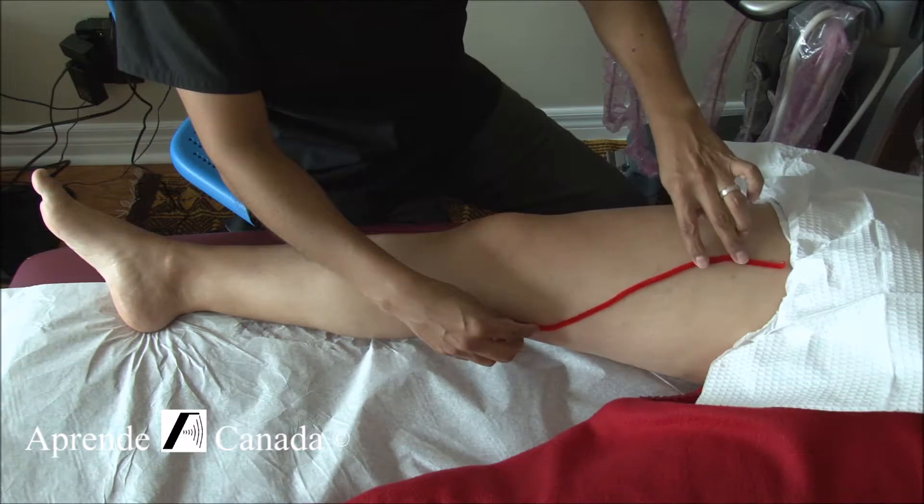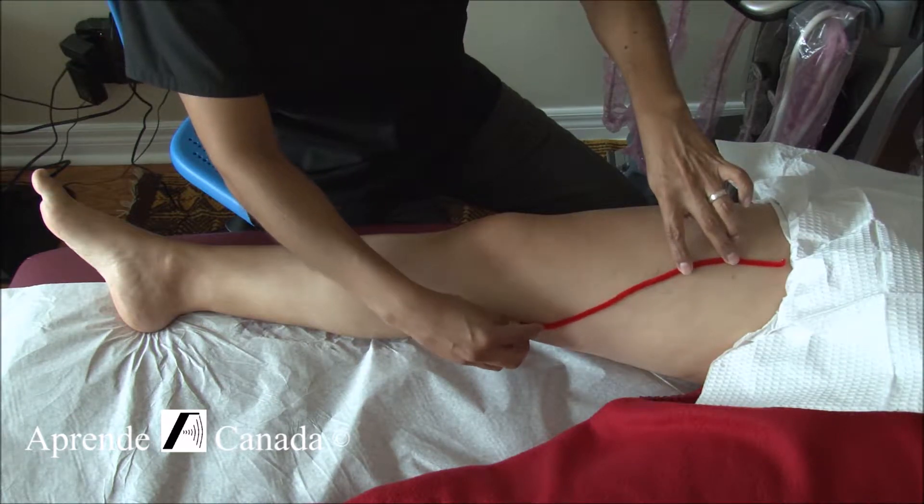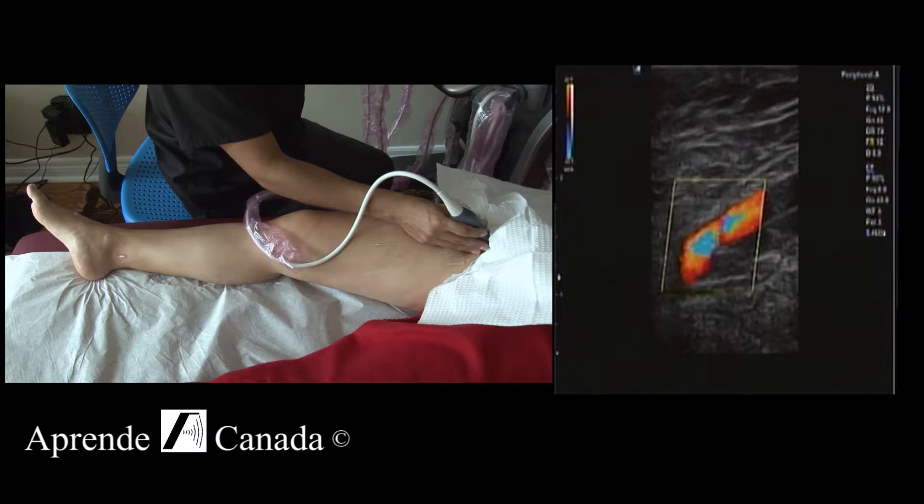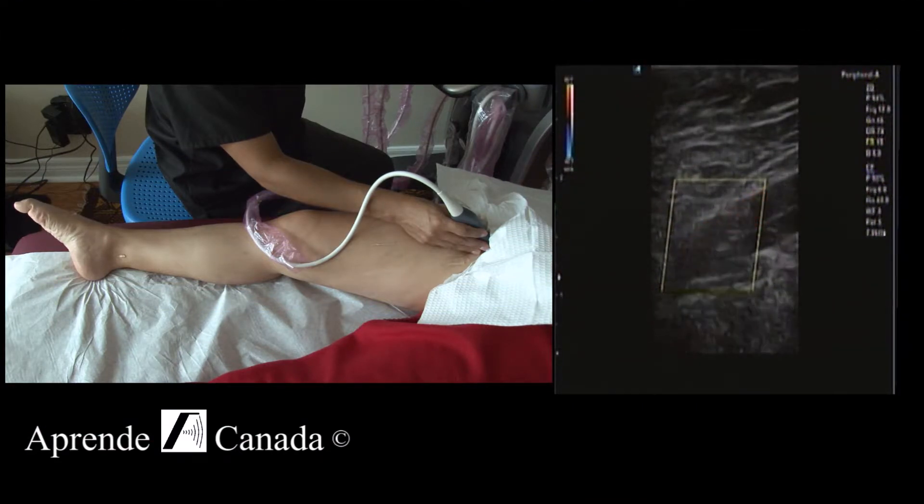The femoral artery to the superficial femoral artery and then down to the popliteal artery, to correct for the scale so that I don't get any aliasing in it.